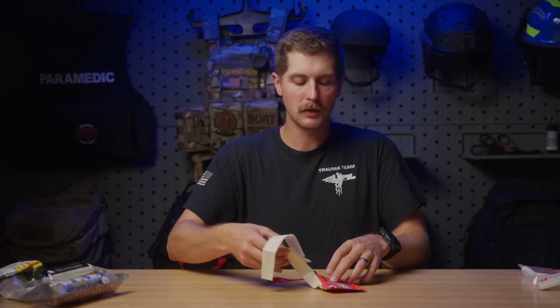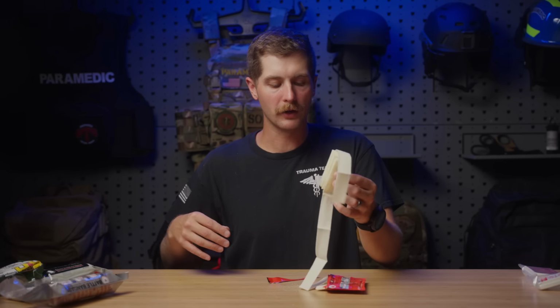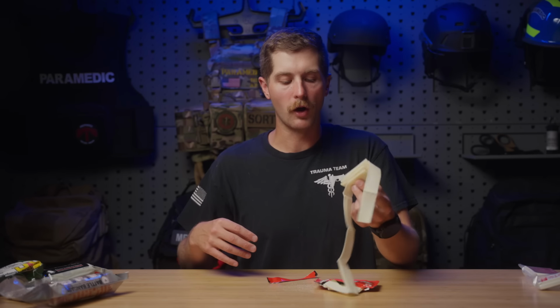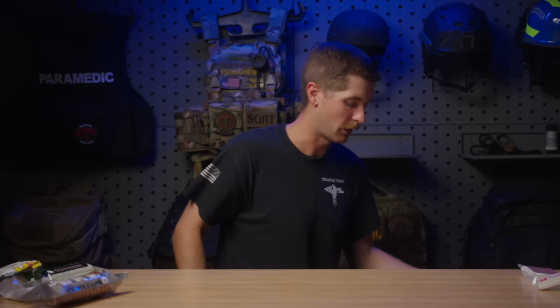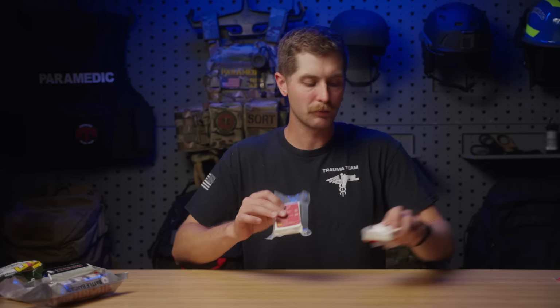There are some studies out there that say that this is going to work a little bit better than your QuikClot in people that are on blood thinners. So this is gonna work a little bit better for that. Once again, though, you can get the thicker gauze there, and that's going to do well. And you can see it's made a complete mess on my desk already. So there is that. Now, coming up next, we have the H&H compression dressing.